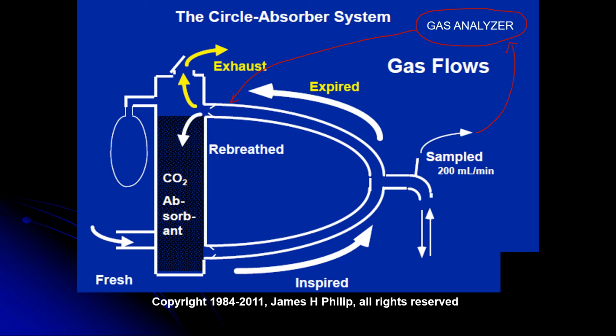You remember why to the expiratory limb, because the CO2 has to remain here in the absorber. Have a look at this valve. We spoke that the flow of gas we put in the circuit has to be at such a level that everything matches what the patient takes minus the CO2. Everything has to stay inside. If for whatever reason the pressure inside the circuit goes more than the limit we established, then the excess pressure goes out. It's lost. The rest of it returns back to the patient.